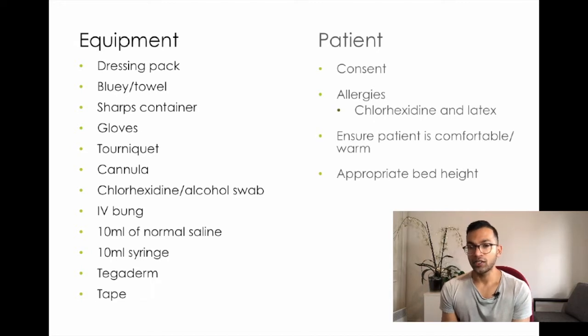In terms of the patient, make sure that the patient obviously consents to this procedure, and then consider the allergies. One of the most common allergies that will occur in patients is chlorhexidine. So it's really important that you check for chlorhexidine allergies as well as latex allergies. Ensure the patient is comfortable and warm. A warm patient vasodilates, a cold patient vasoconstricts.